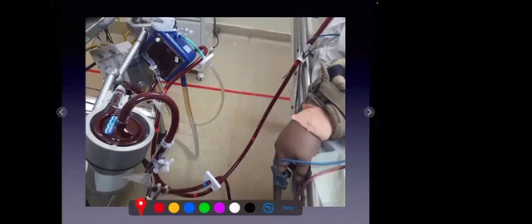And after the oxygenator, there is another circuit which is coming out and goes back up here, and this goes to the infusion, the arterial cannula, or the cannula through which you are giving back the blood. This is a VV ECMO patient, and this is the general design of the circuit, and this is how it is handled. So one cannula, the drainage cannula, has a drainage circuit, gets to the pump, from the pump goes to the oxygenator, from the oxygenator goes back to the patient.